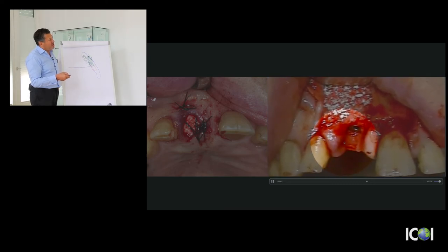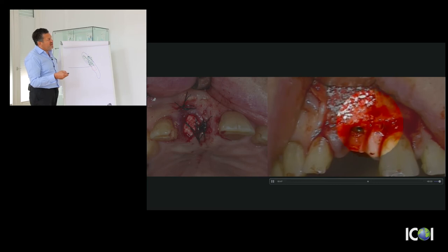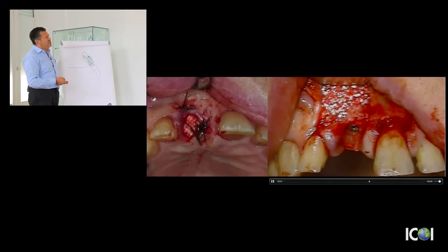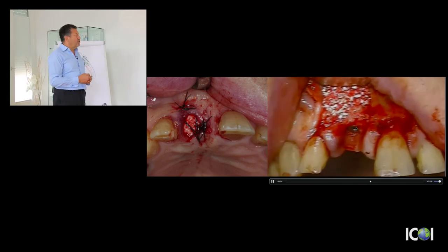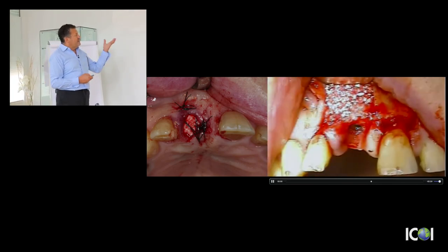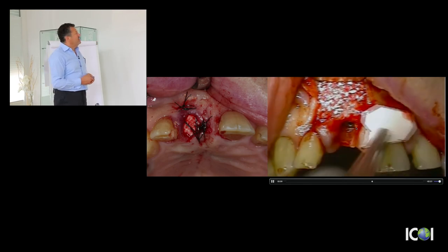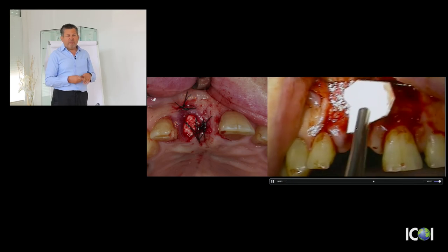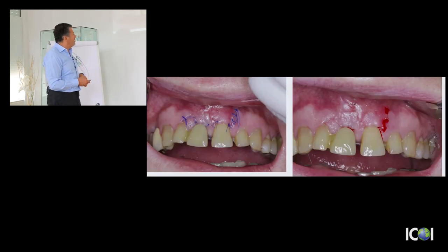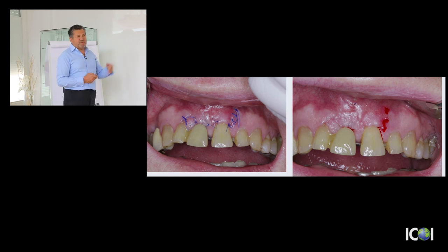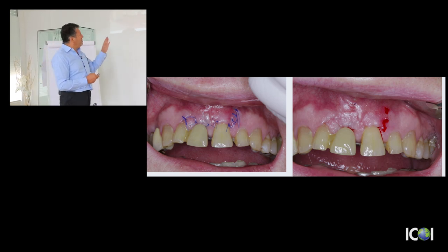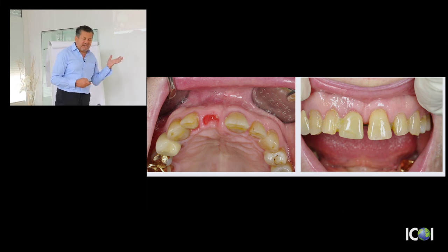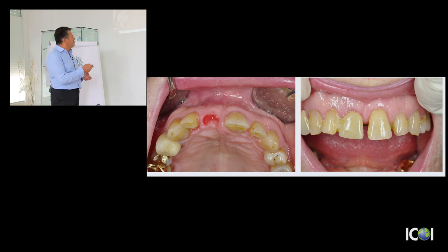The soft tissue harvested with the punch will be used as a connective tissue graft to improve the soft tissue so the crown will have a very natural look. The flap is closed with double sling sutures using 5.0 suturing material, everything back in position. Sutures are removed early, and we have a very good follow-up with excellent volume maintenance.